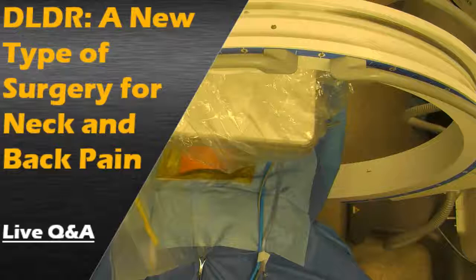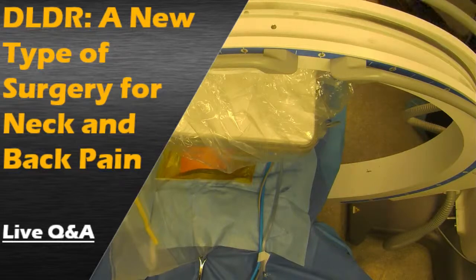Endoscopic spine surgery on a patient with a painful disc at L5-S1, I believe, correct? Yes, sir. Now our patient has more than one herniation in his back, but we're doing just the one today by choice by the patient. I think he's got 2 discs that are painful, but we're doing just the L5-S1 today. This is again by patient's choice, not mine.